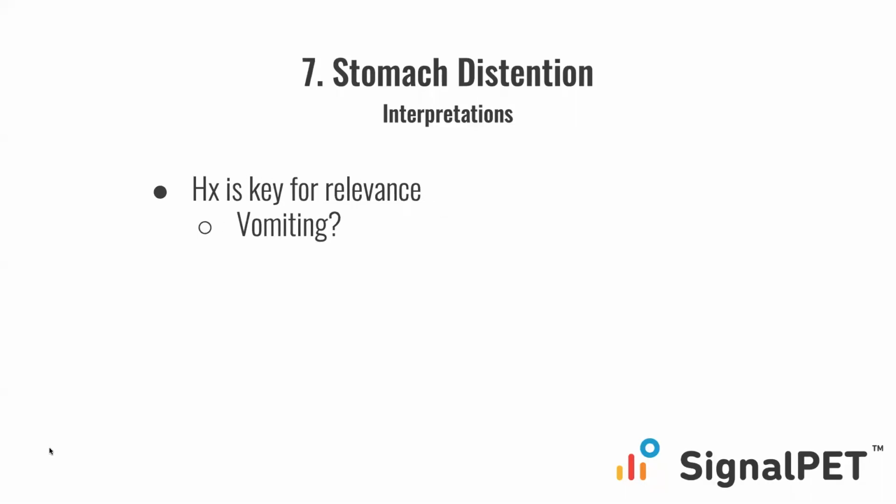Not the most significant clinical finding unless there's a history of vomiting. And that's how, in practice, I would always view gastric distension. Is there a history of vomiting?